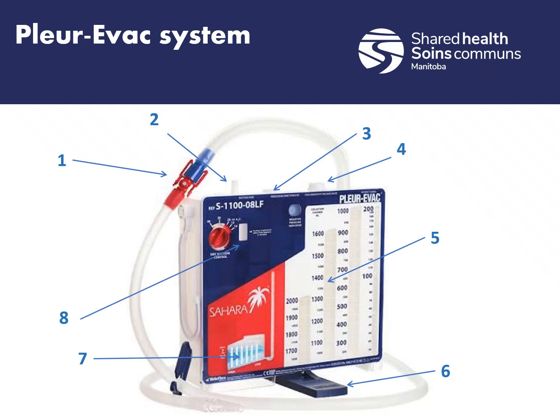Next thing we have is our suction control indicator. This one's kind of important, especially if we're using wall-mounted suction on these devices. This is an orange float in a window that means prescribed suction is imposed. So this shows you that your suction is working effectively and you have a good seal.